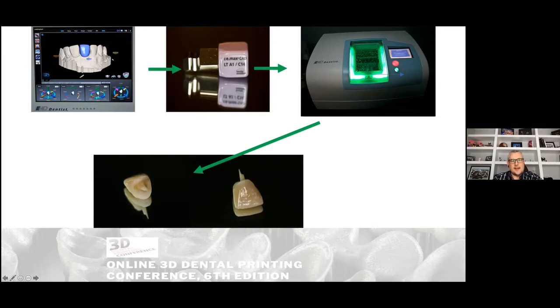Now that we've done that, how do we go from the digital design to an actual tooth? Here, we're utilizing a dental ceramic. This is called EMAX, otherwise known as lithium disilicate. What we're doing is placing it in a milling machine. Okay, and here's where some drills come out, and they carve the tooth out of this block. What you see is the end product here. Now it does come out purple or pinky, and we still have to expose it to some temperature to get to the final product.